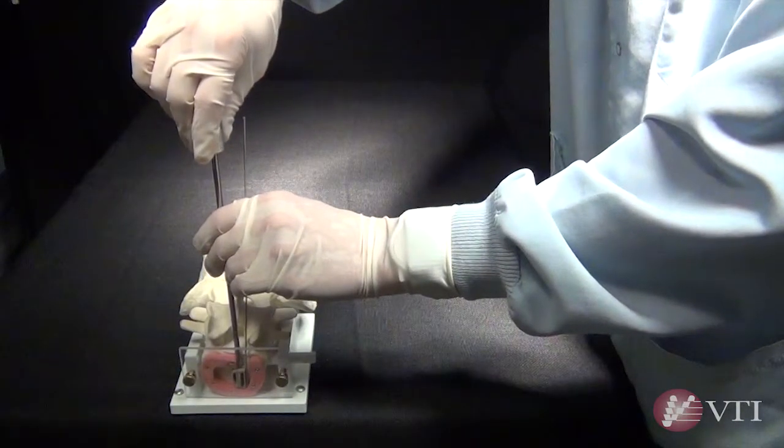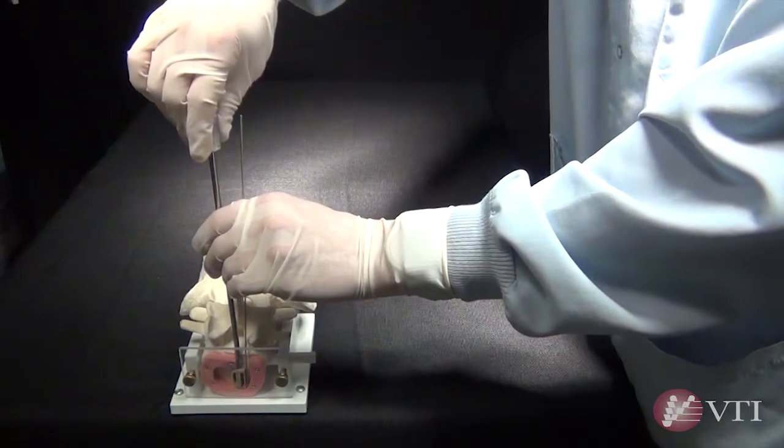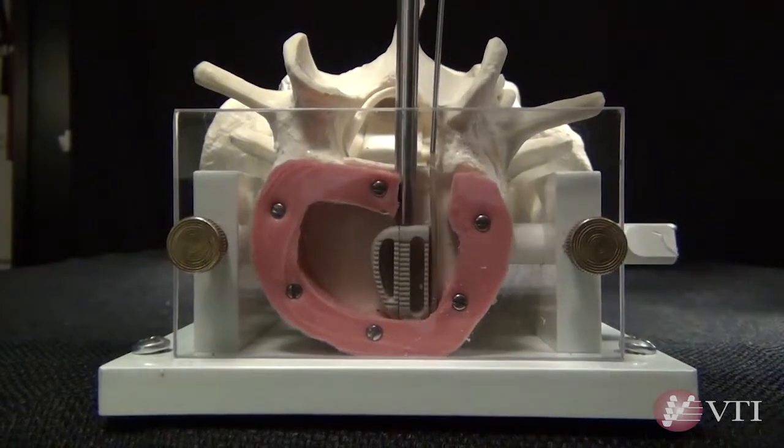Once the tail removal tool is in proper position, twist the tail removal tool one complete rotation to remove the tail from the segment.